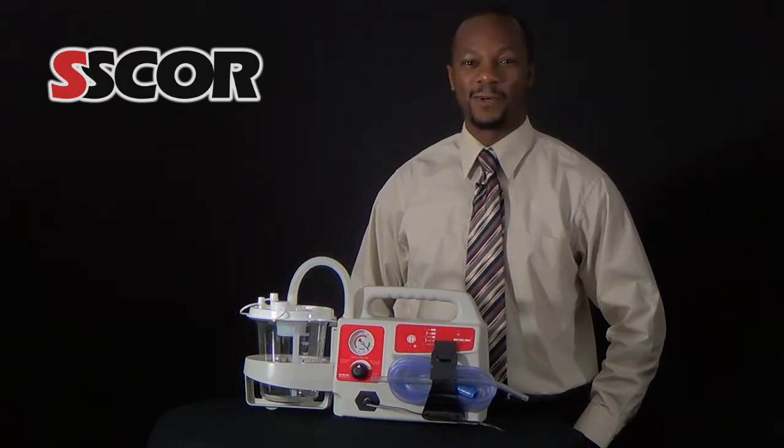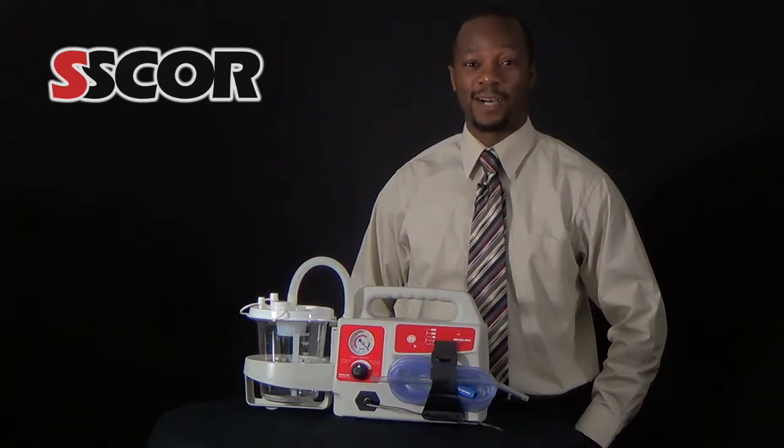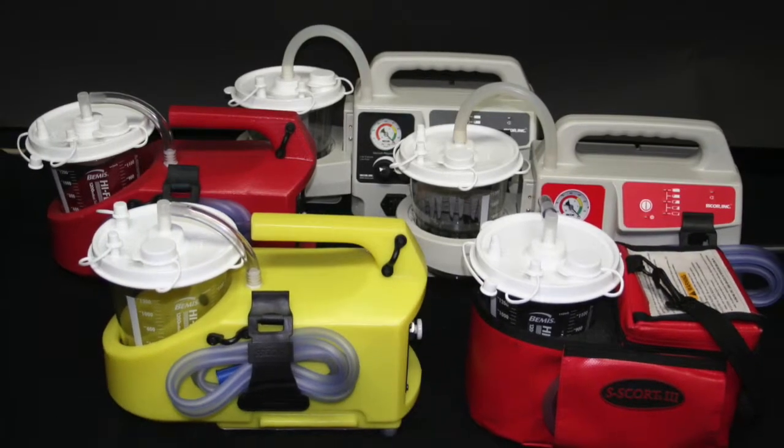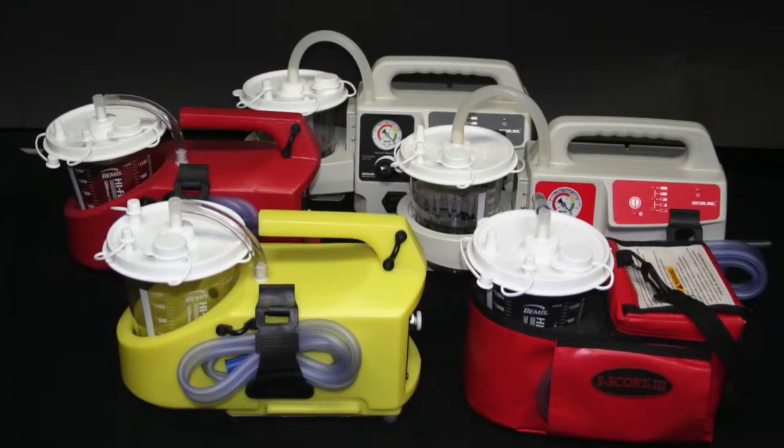Hello, I'm Craig Lynch with SSCOR and I want to show you a quick and convenient way to assess the capacity of the battery in your SSCOR aspirator. This test applies to the S-SCORT III, 9, 10, and 2300 series aspirators.